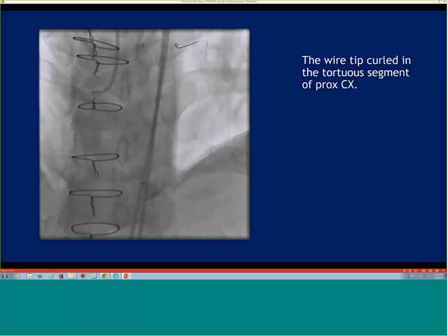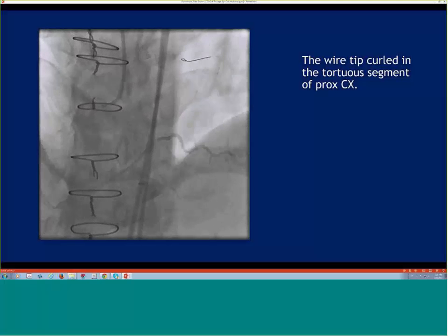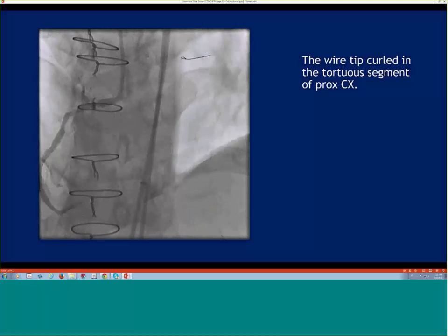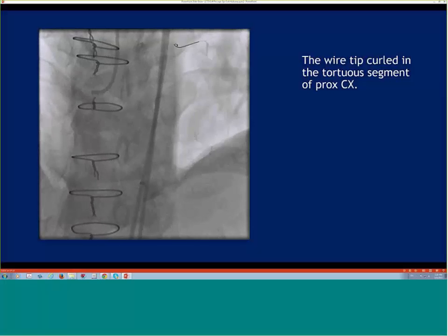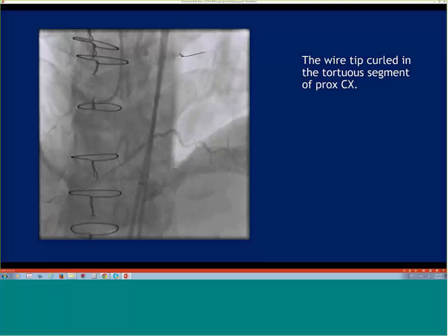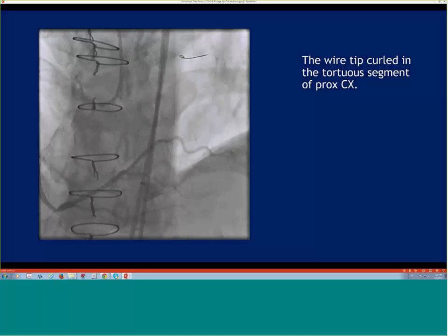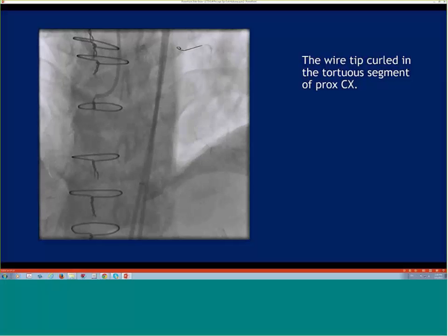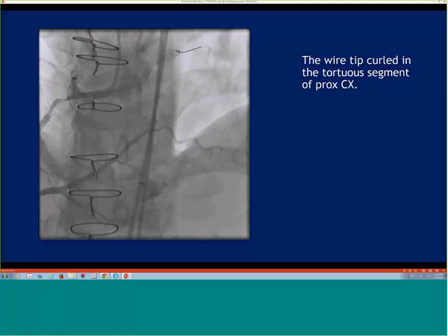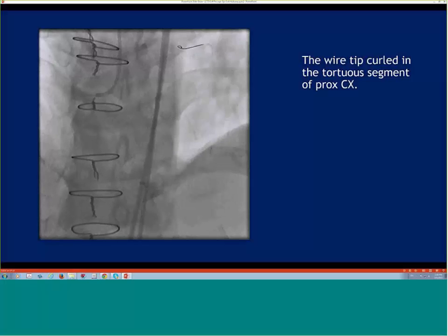And I know you're aware of it, Manos, but in the setting of a CABG, there are about 10 reported cases of localized hematoma in the left atrial wall or in the pericardial space, which has compressed the left atrium and caused some catastrophic results. So even with the protection of the previous bypass, I was a little uneasy about the next step, which would be to put a guide liner down and increase your support to try to get the Corsair or the Fine Cross into the epicardial vessel. Because of this, I was uneasy about increasing my level of support.